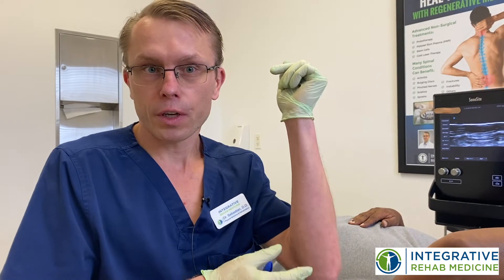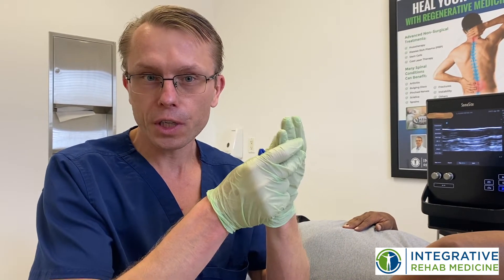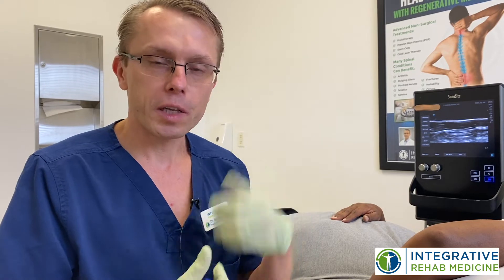Today I'm going to show you how I perform a hydro dissection of the ulnar nerve. This patient has ulnar nerve damage, a little neuritis, which causes some symptoms in his fingers and his elbow. What we're going to do is use some injections around that ulnar nerve just to decompress it, allow that nerve to feel free and recover, and hopefully eliminate his symptoms.